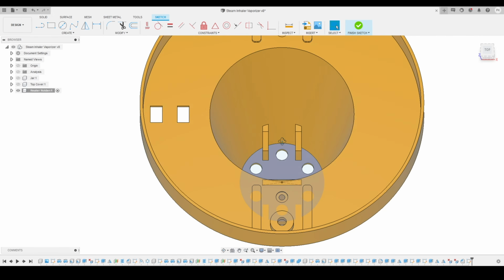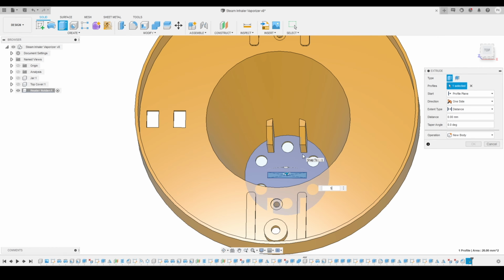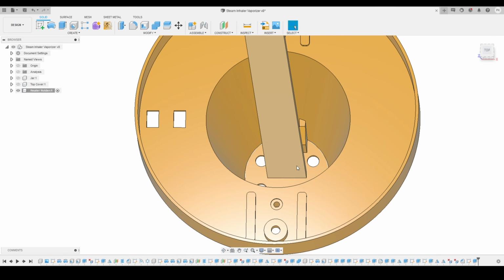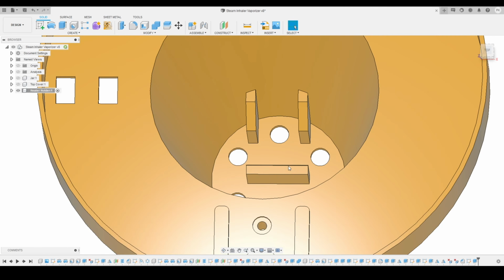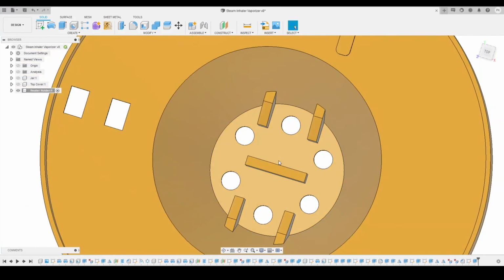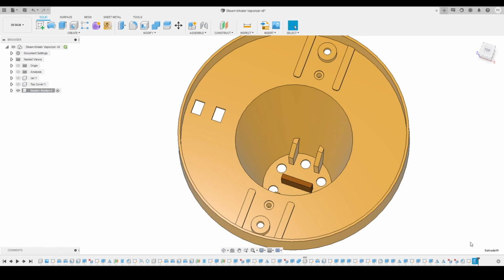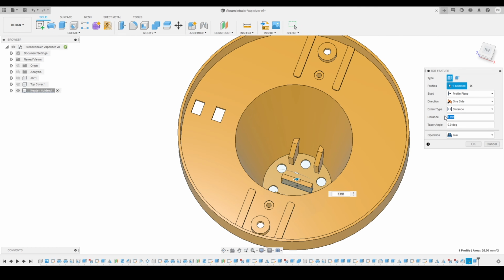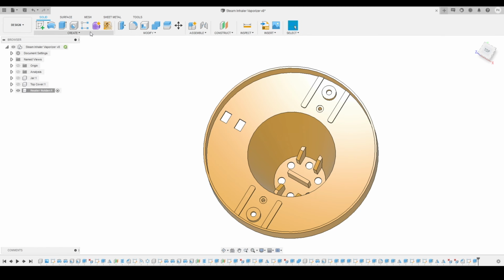Now we'll click on finish sketch, then we'll activate the extrude tool. Now we'll select the profile, and we'll give it a distance of 5 millimeter maybe. It's something wrong, so I will just edit the feature again by double clicking on that particular feature, and we'll correct it to maybe 7 millimeter, and here you can see the results. So it will also help the plates to not touch each other. So I just created a boundary kind of thing, and here we'll change the height a little bit higher. I think 10 will work. So here you can see.